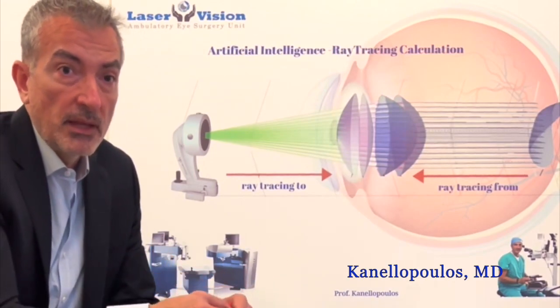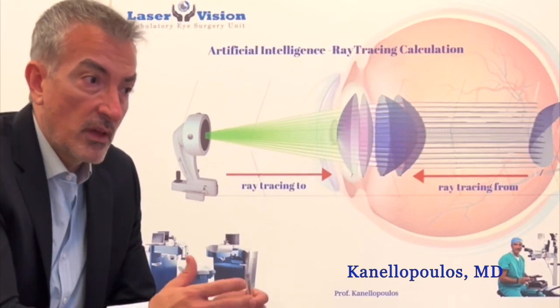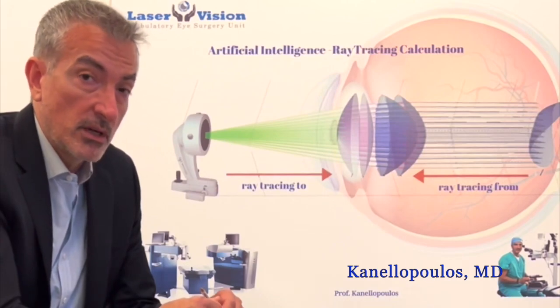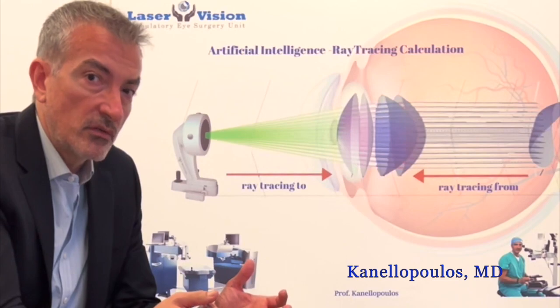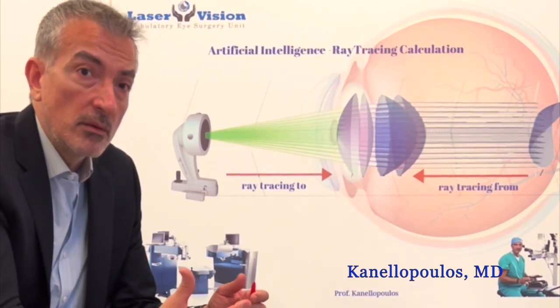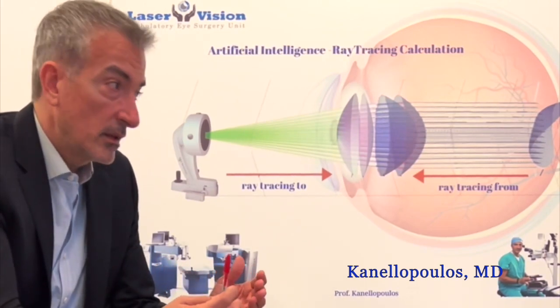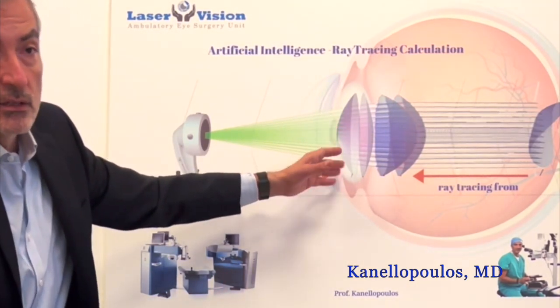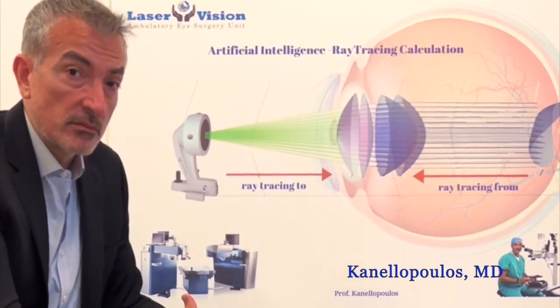It's quite expected in our days to achieve 20/20 vision with any excimer laser under any platform, customized or not. If we're pursuing not just 20/20 vision, but the ability, besides correcting the refractive error, to improve the optics of each individual eye, because we know the cornea is not always lined up with the line of sight, so there's angle kappa.